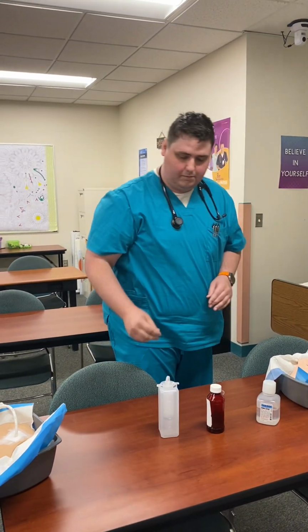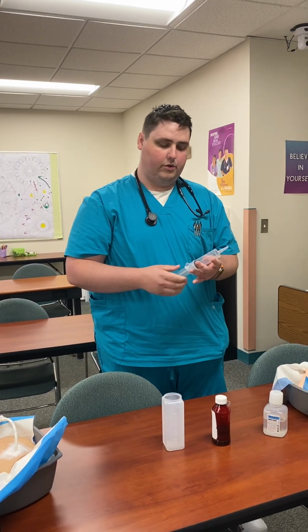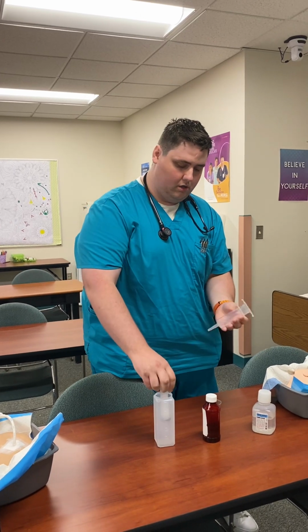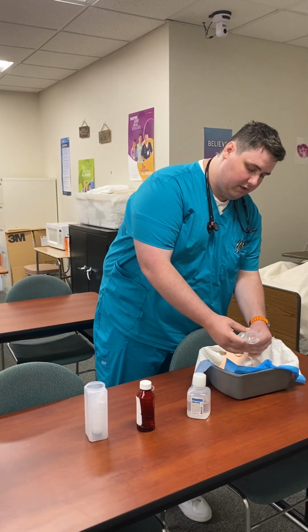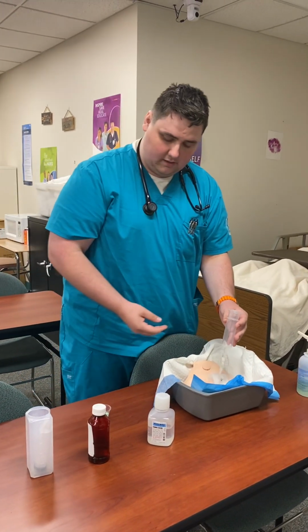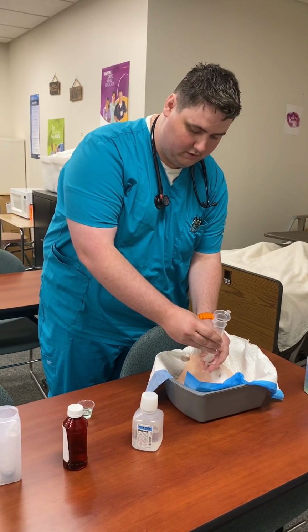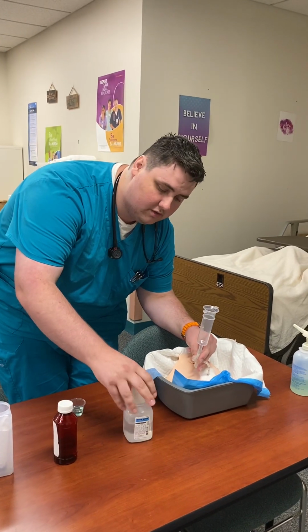So for the process of administration, because all PEG meds are done through a gravity system, you remove the back end of the plunger so that you just have this part. You'll be putting this attached back in, upon which you will clamp down on the tubing so that you are able to make sure that your med stays in the correct area.